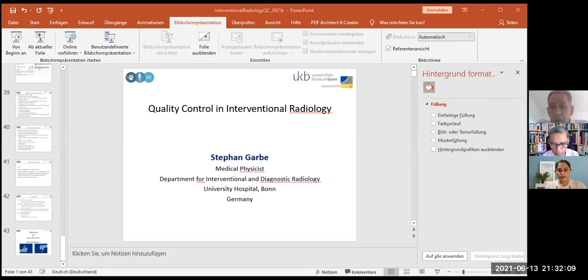This is leakage to the patient, not leakage to the personnel. That's the reason why I would cover the X-ray tube, because that would be dose to personnel. We are looking for the dose to the patient, so we have to look at what is actually the leakage through the slit system. But we have to prevent all the other leakage from coming into the room and getting scattered three times. So I hope this was clear.